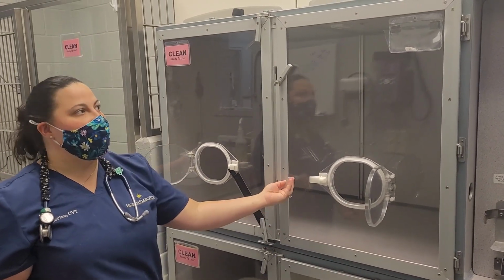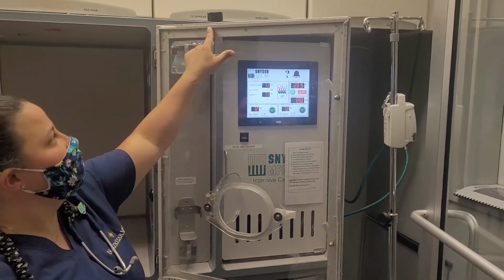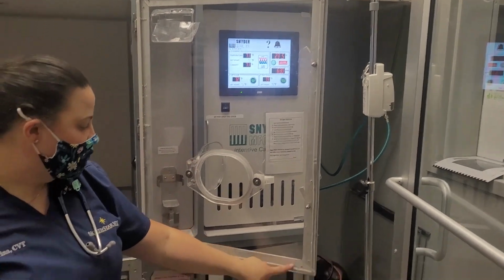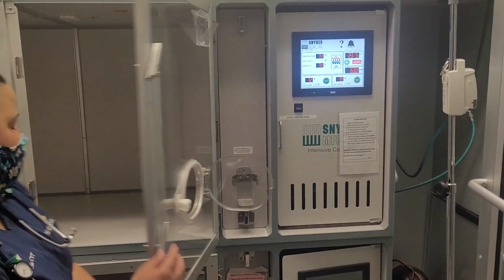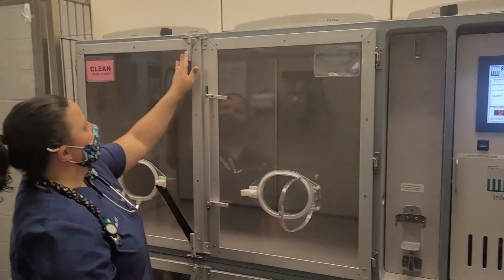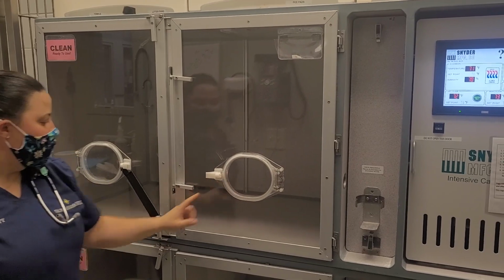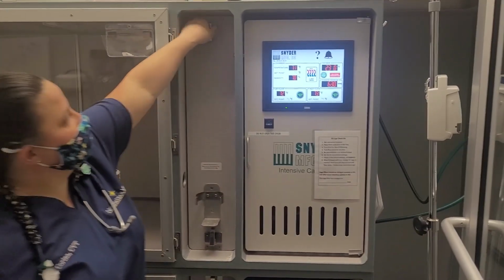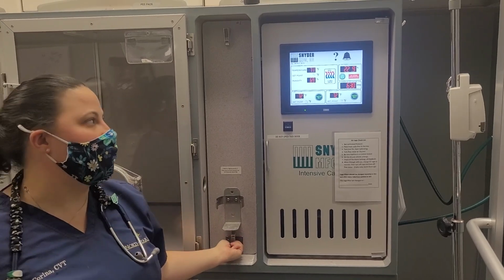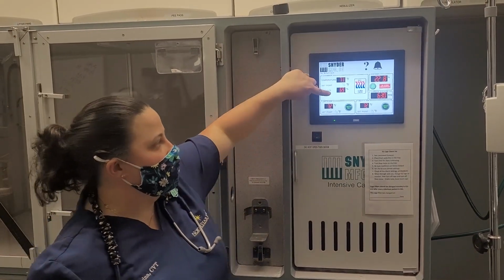Or if you don't have a thorough seal on your actual cage door. So if your stripping is missing, you will have a leak on your cage door as well. So we want to make sure that everything is nice and tight. All your doors are closed, all your levers are latched, and that your B door is closed and locked, secured as well.